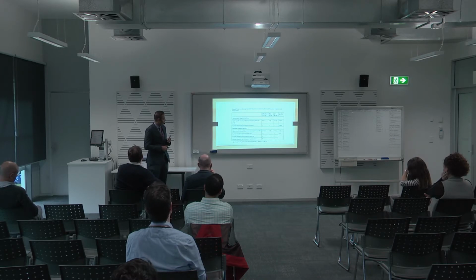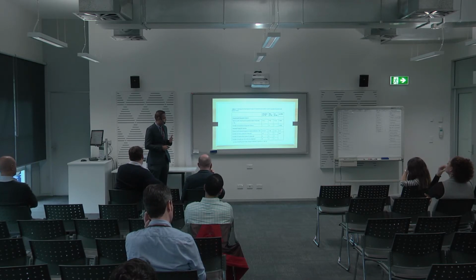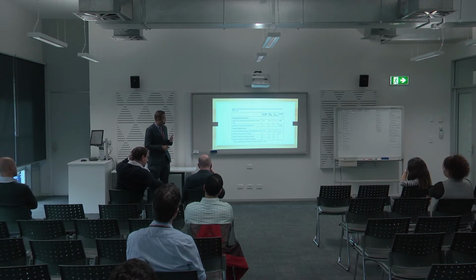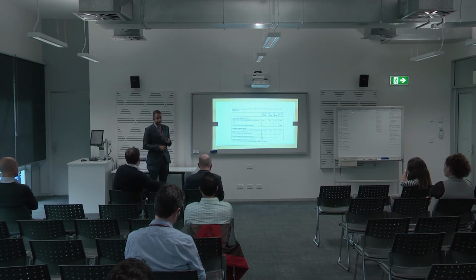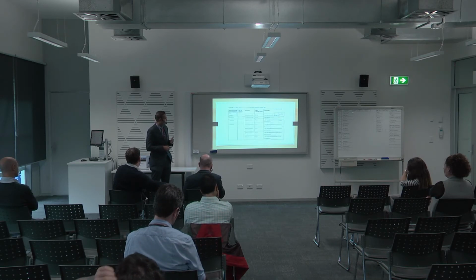And if you look here, white light endoscopy, so that's normal standard colonoscopy, did not pick up any single lesion, as opposed to chromoendoscopy, which picked up 12%, so 4 patients out of 34 had this. And the number of lesions was 7 in total. So these were statistically significant. If you look at polypoid dysplastic lesions, the pickup rate was quite similar, because you don't need special stains for raised lesions. They're quite easy to visualize.